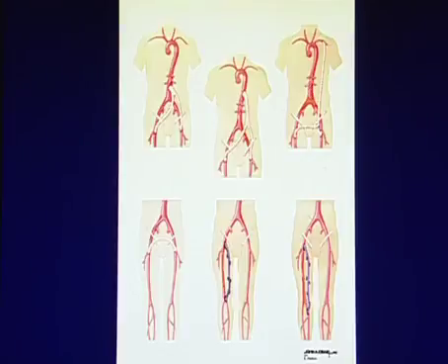There are a number of different types of grafts out there. Most of the examples in the presentation today will be autogenous vein. You can use vein either in an in situ orientation or a reverse vein orientation, and it's really important before you begin your evaluation of a bypass graft to get the op note so we understand what the inflow and outflow vessels are and what orientation that graft has been placed.